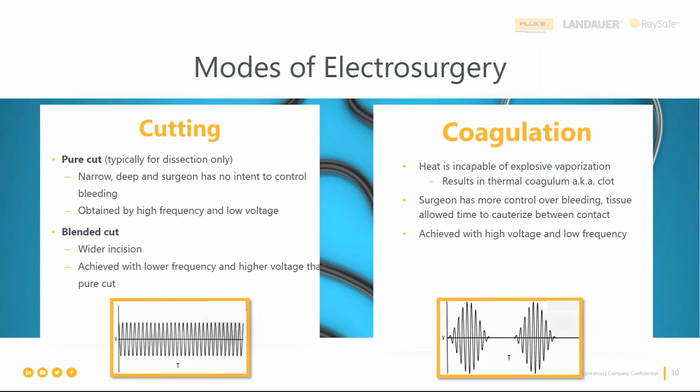And it's going to take a little bit of extra setup to do this. You're going to probably have to have an oscilloscope. Let me rephrase that. You will have to have an oscilloscope, but in how you're going to tie that oscilloscope in, with the Fluke solution, it's easy. It goes right to the back of the QES3 with your 10-to-1 attenuation cable, and you can then set up your oscilloscope, and you can actually look at these waveforms. The one I know for sure is an Olympus. Olympus calls for you to do this. No, it's great. It just makes sure that you're passing, right? Because if we just blindly go by the numbers, you could be missing a waveform issue. Correct, that's the main thing here.